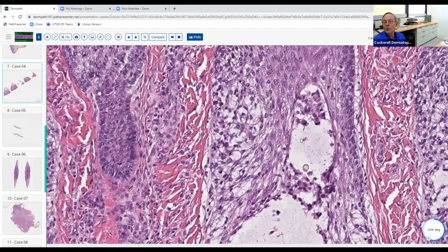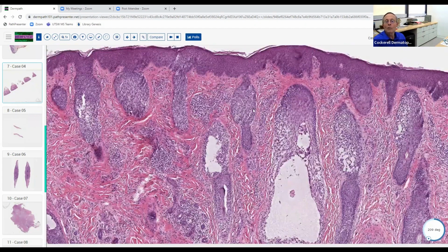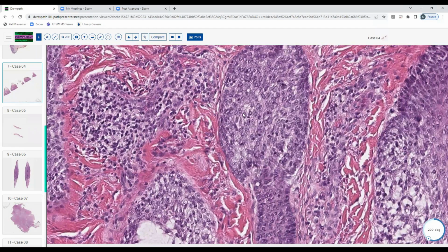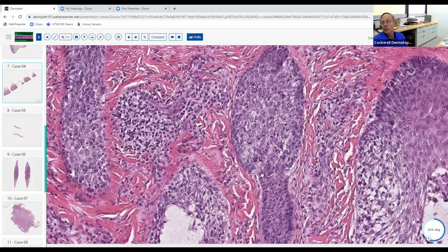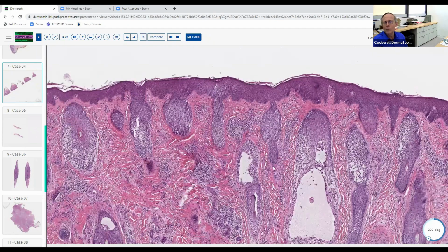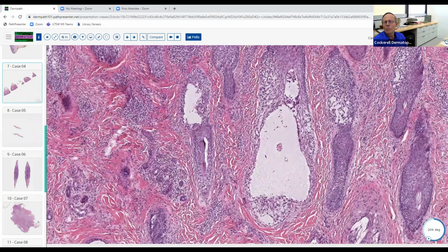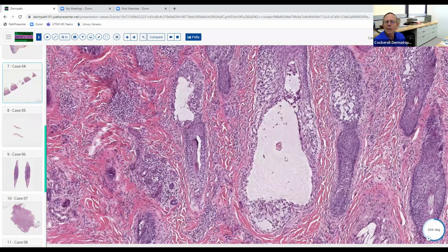But the point is, if you just see follicles with some pallor in there, it's really hard to be absolutely 100% sure that this is mucin. So if you just had this, you might actually stain it. You usually don't need to stain for mucin in my experience. The vast majority of the time, you can identify mucin with just routine evaluation.